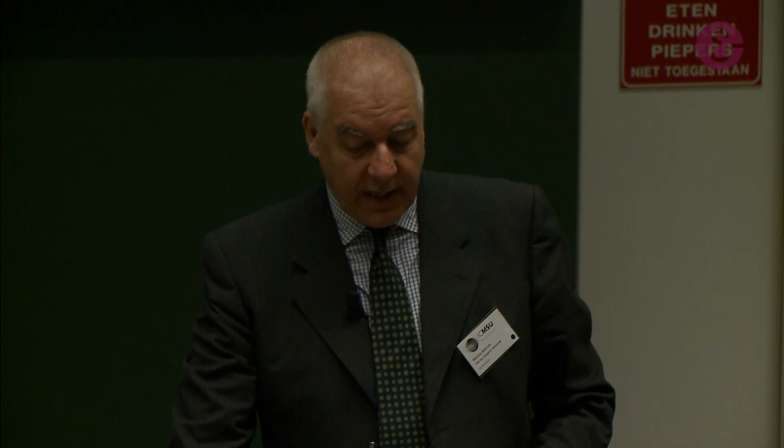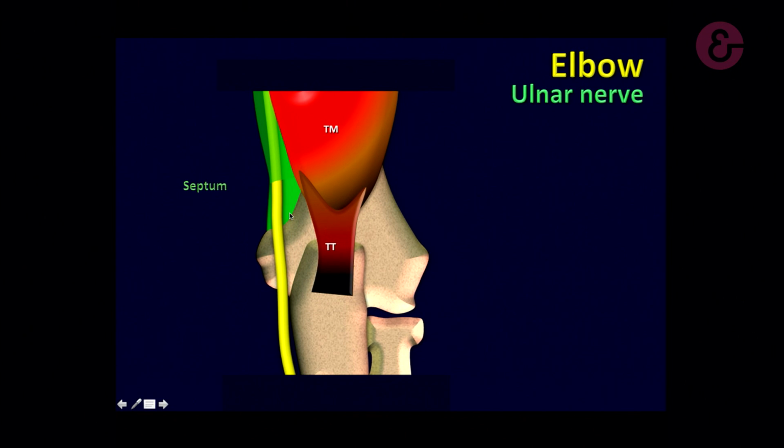The ulnar nerve comes down on the posteromedial side. It can be compressed at the level of the intermuscular septum of the arm, at the level of the retinaculum, or the arcade of Osborn. There is a lot of confusion in terminology, also in anatomy. Some people talk about the retinaculum, including the Osborn arcade. Others differentiate the two structures. It's not so important for ultrasound.